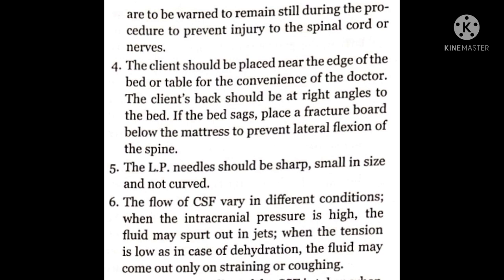6. The flow of CSF varies in different conditions. When the intracranial pressure is high, the fluid may spurt out in jets. When the tension is low, as in case of dehydration, the fluid may come out only on straining or coughing.